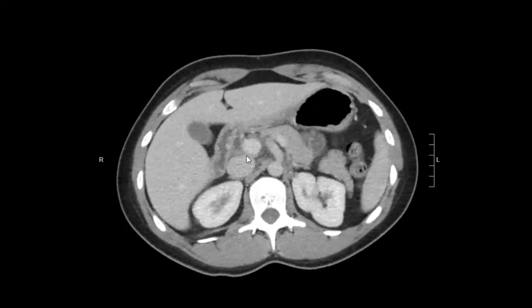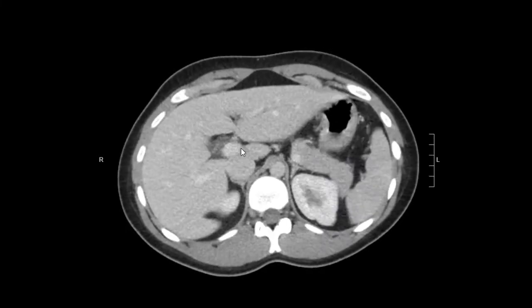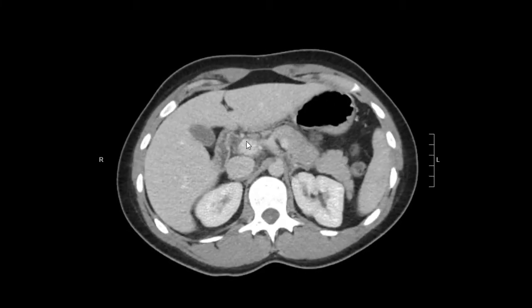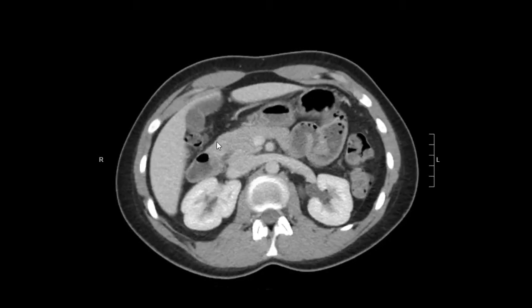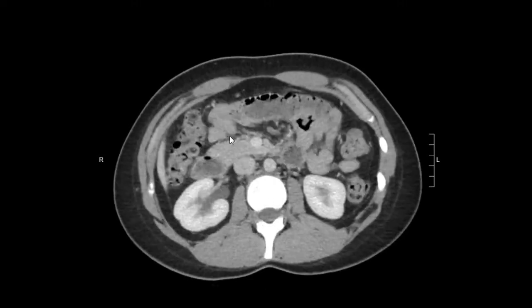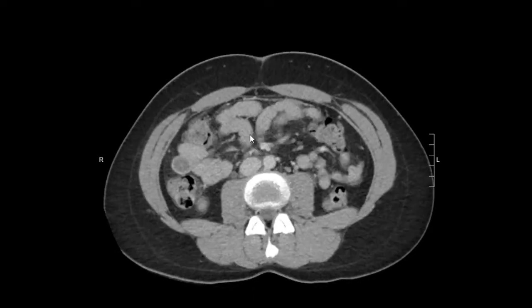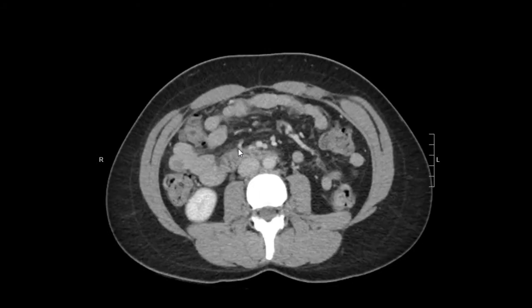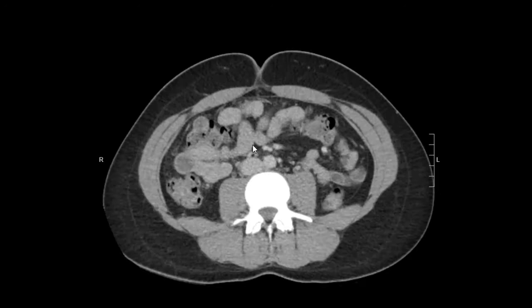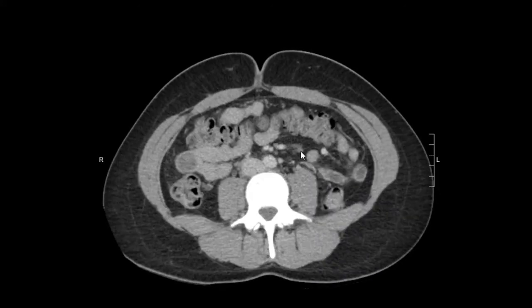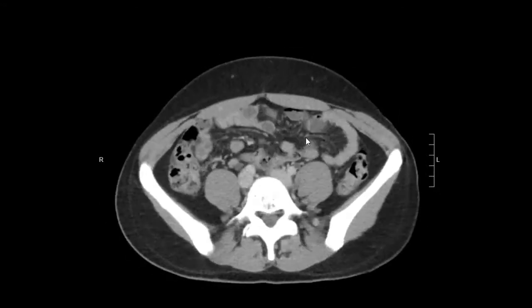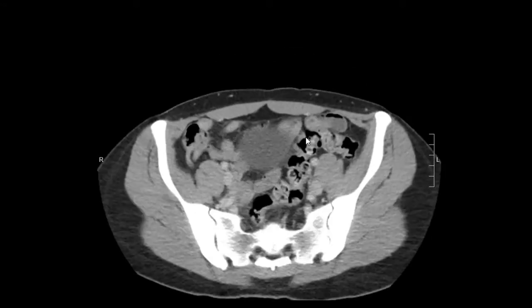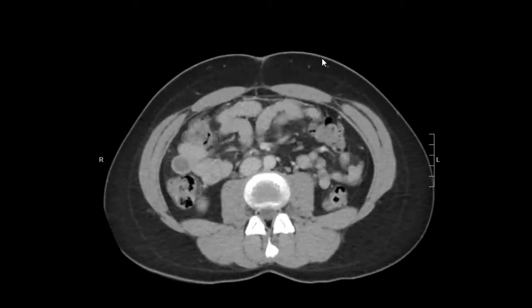We're going to look at the porta hepatis for any abnormal lymph nodes, and then through the abdomen for any abnormal lymph nodes. Here's an example of a lymph node — these are just small soft tissue structures that blip in and out as you scroll up and down.